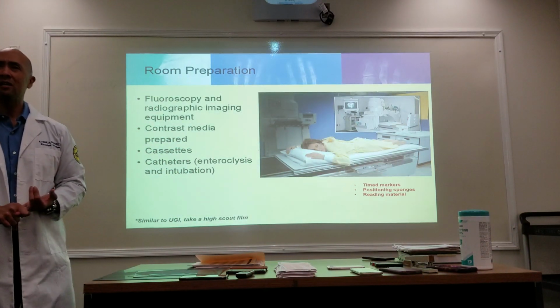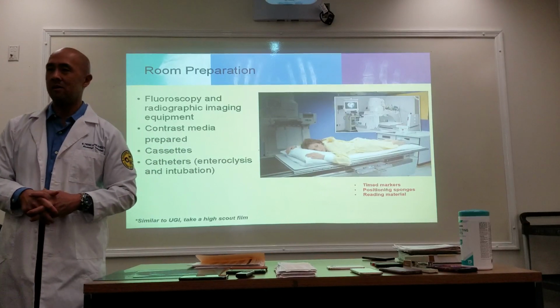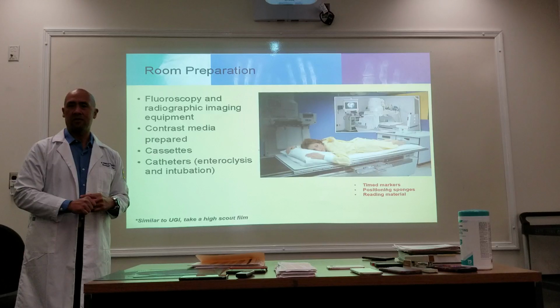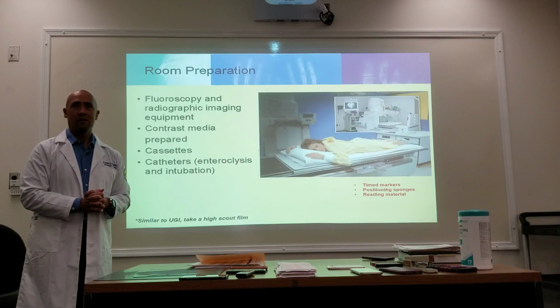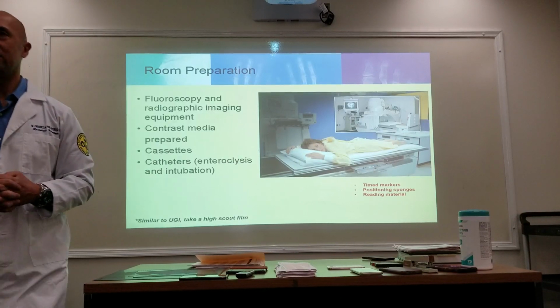I'm old school, so you guys are going to have to educate me on this. Do you guys have timed markers? They're like your lead markers, but there's times on there. They have them, but everyone just annotates everything. So everyone just annotates everything, okay.